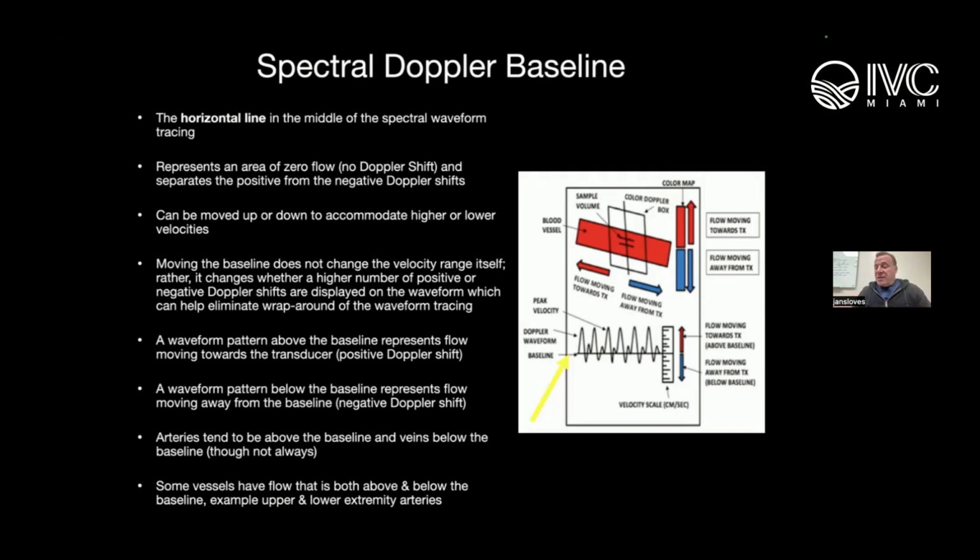So typically when I'm doing a reflux study, I set it to the lowest that's attainable on the ultrasound system, right? Or I should say, the most minimal or slow. So this way, I'm able to measure the entire length of the reflux. That's really the point here. So to get the velocities and the reflux time, that's really where the value of the spectral Doppler is. You can't really do that with color only. Correct? That's accurate, correct? Yeah.